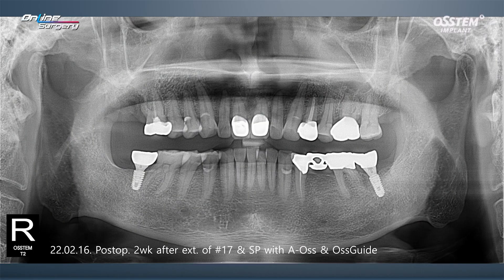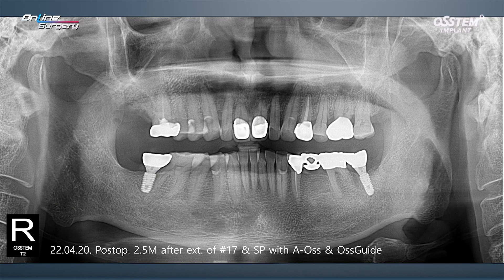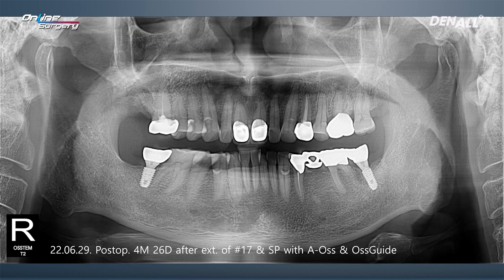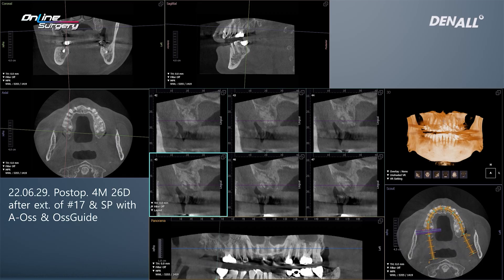About two weeks after surgery, this is the panoramic image. This is 2.5 months later. This was at 4 months and 26 days — almost 5 months. In the area where socket preservation was done, bone formation could be observed.